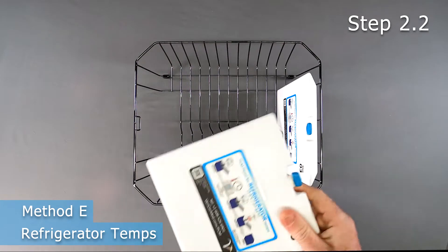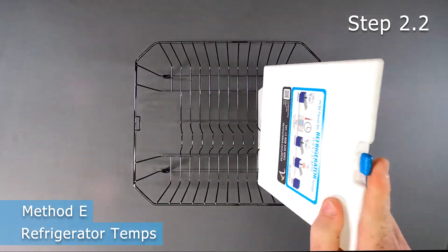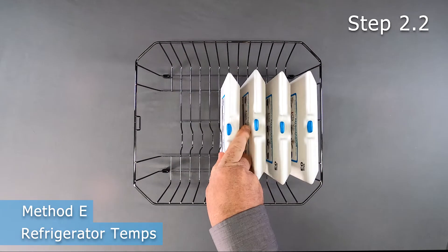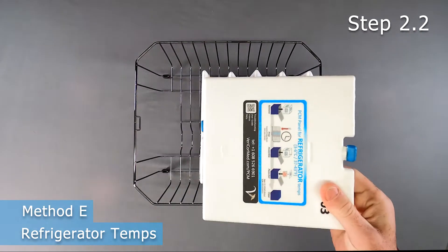Prior to pack out, separate the panels to allow airflow on all sides. They do not need to lay flat, so placing them on a wire rack or gapping them with spacers will provide the necessary air circulation.